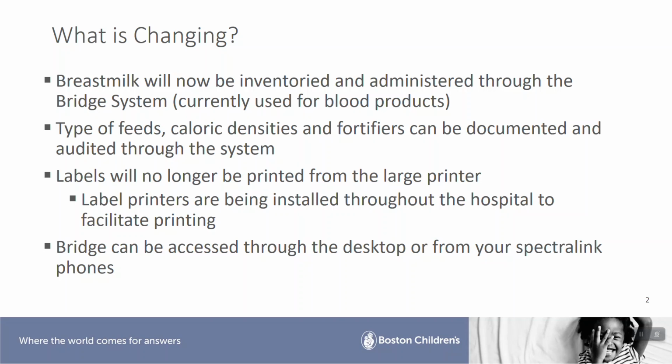Through Bridge, we can also perform electronic barcode administration scanning for breast milk and formulas which are made in the milk lab. Caloric densities can be tracked and documented in PowerChart for better assessment of patient caloric intake.